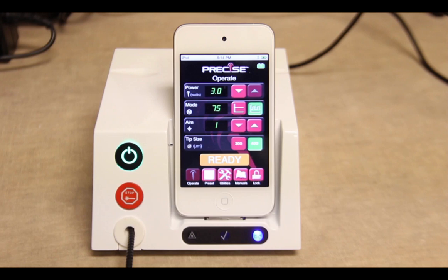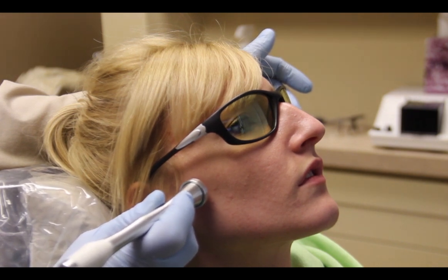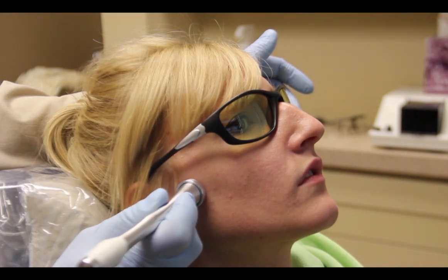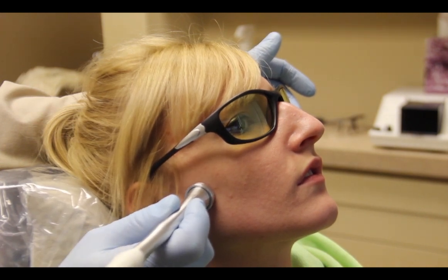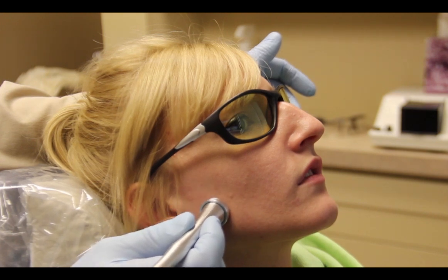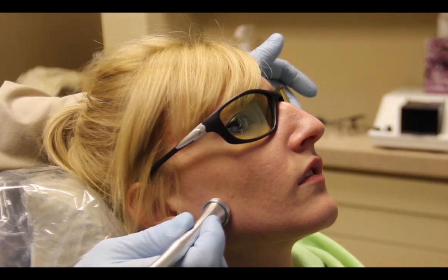We're using a special attachment that will be placed lightly on the area in which the patient is experiencing the pain. We can treat the actual joint area, or we can treat the masseter muscle or the temporalis, wherever the patient is exhibiting the pain. We're slowly moving over the area, allowing the laser energy to penetrate into the skin and into the inflamed areas.